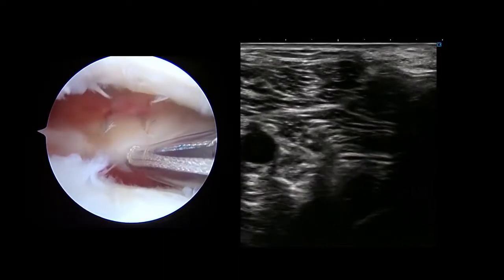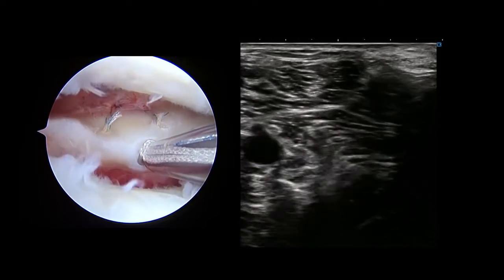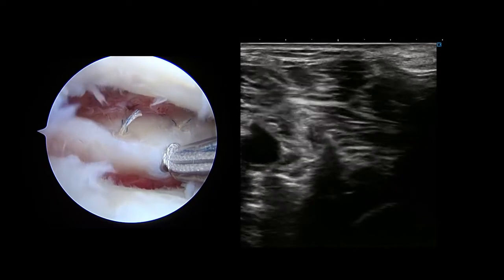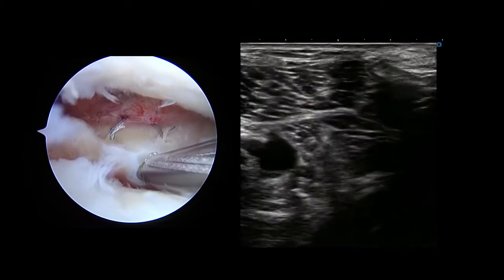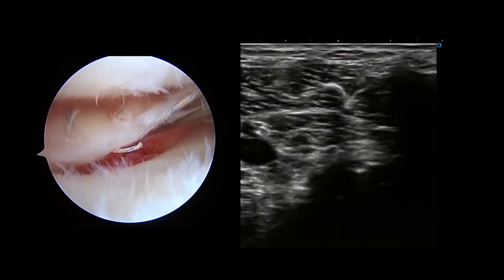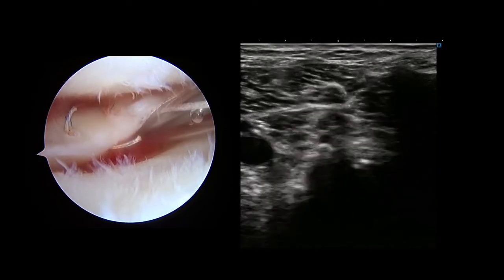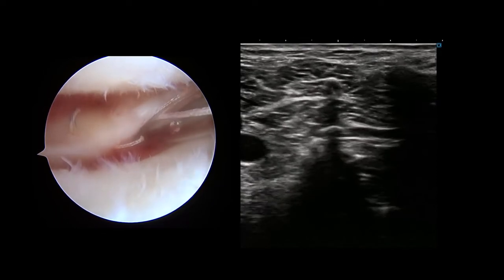The same procedures are then repeated. The location of the popliteal artery and the direction of the needle are confirmed by ultrasound every time. If the needle is directed toward the artery, it should be extracted and inserted again. A total of four sutures are performed to obtain stability of the LM under the assistance of ultrasound.